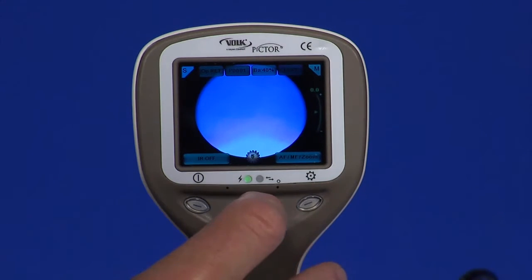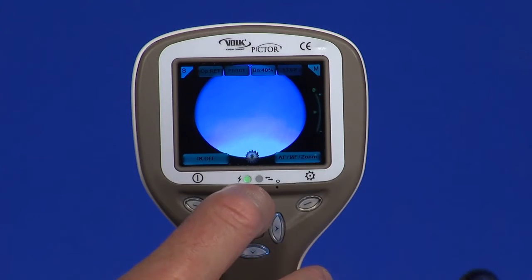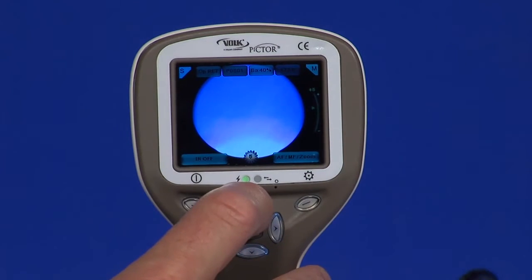To adjust for refractive error, press the arrow key up or down. Each click is approximately one diopter.